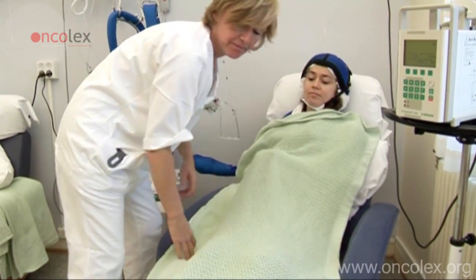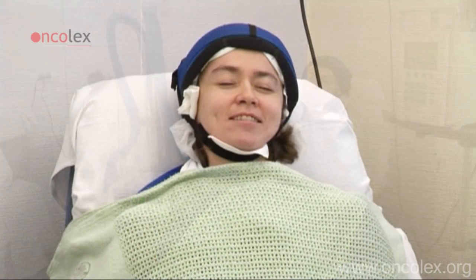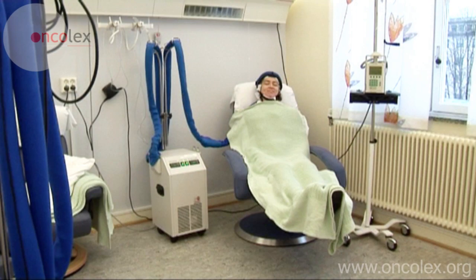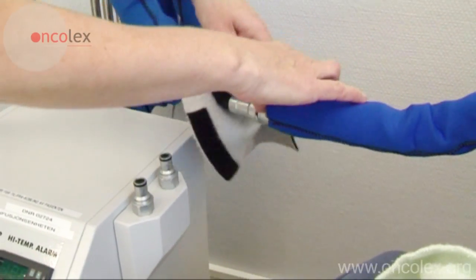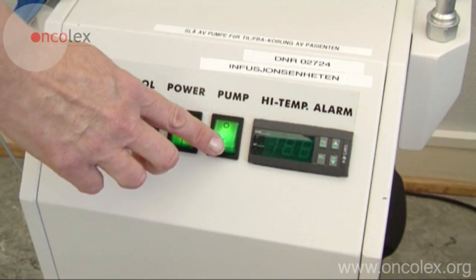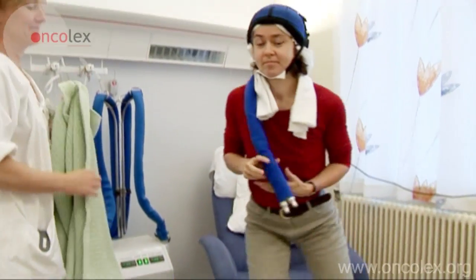The patient should wear the cooling cap for 30 minutes before starting the chemotherapy infusion, during the entire infusion, and for 1.5 to 2 hours after the infusion is finished. If the patient must use the restroom during the treatment, turn off the pump and disconnect the cooling cap. The cap should remain on the patient's head when using the restroom.